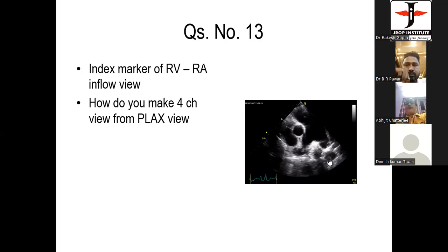See, suppose I've got a person with patent ductus arteriosus. And I'm looking at this view. So what are the findings that I see here? If you know, you answer me. Otherwise, I'll change my question. Don't worry. No, sir, I don't know. You have been doing Dopplers? No, sir. This is my first online course. Have you ever handled the machine? Since a few days, I am handling it. Since this course has started, I'm handling the probe.